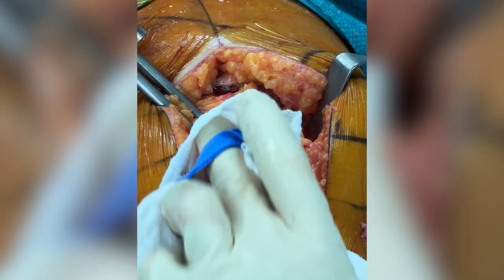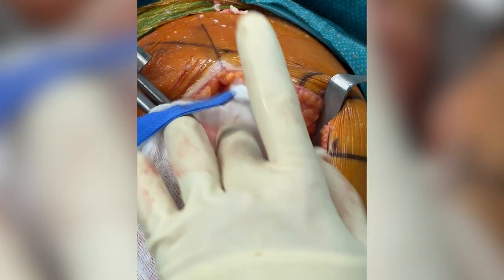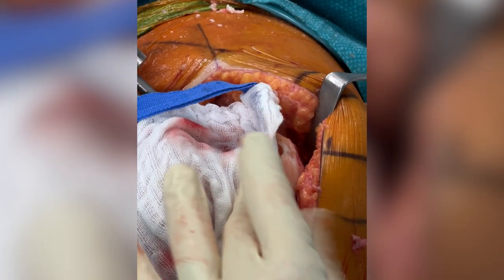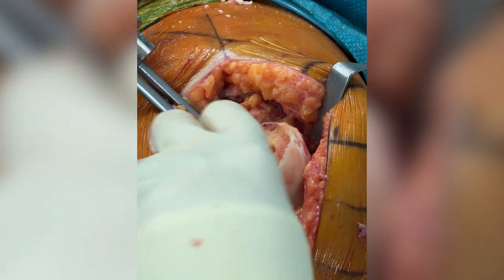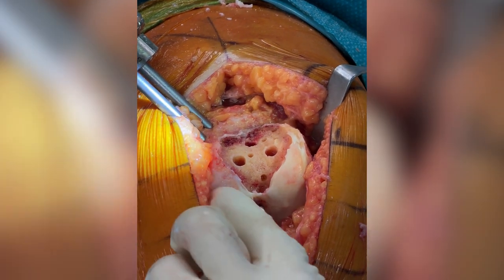Let's clean up and make sure we have a dry area for cement fixation of the component. I'll ask the nurse to start preparing the cementation.